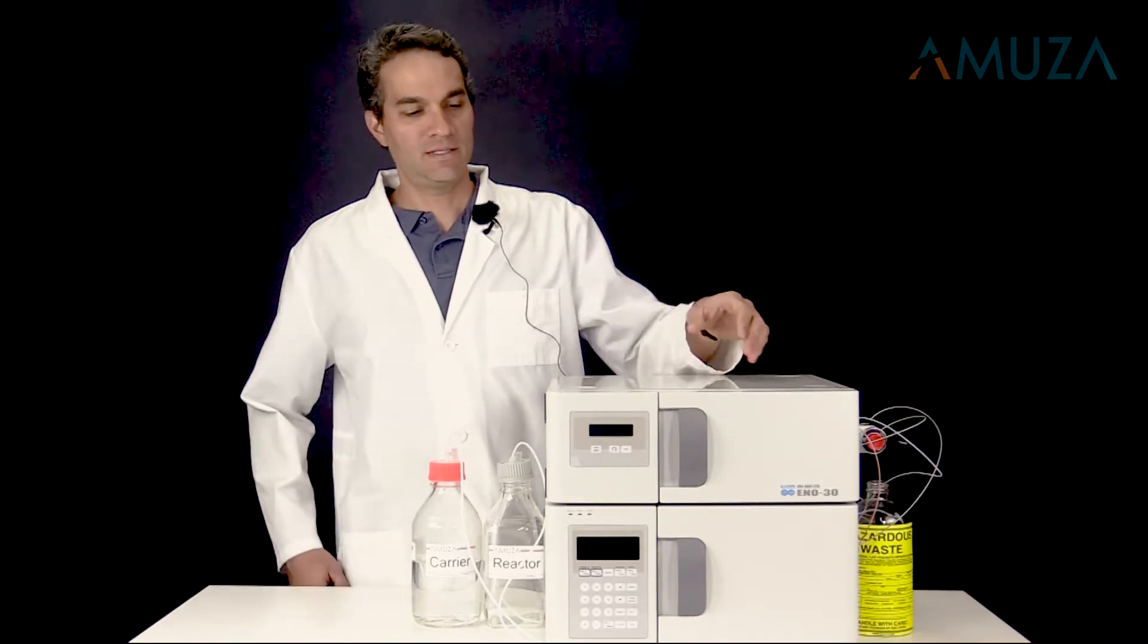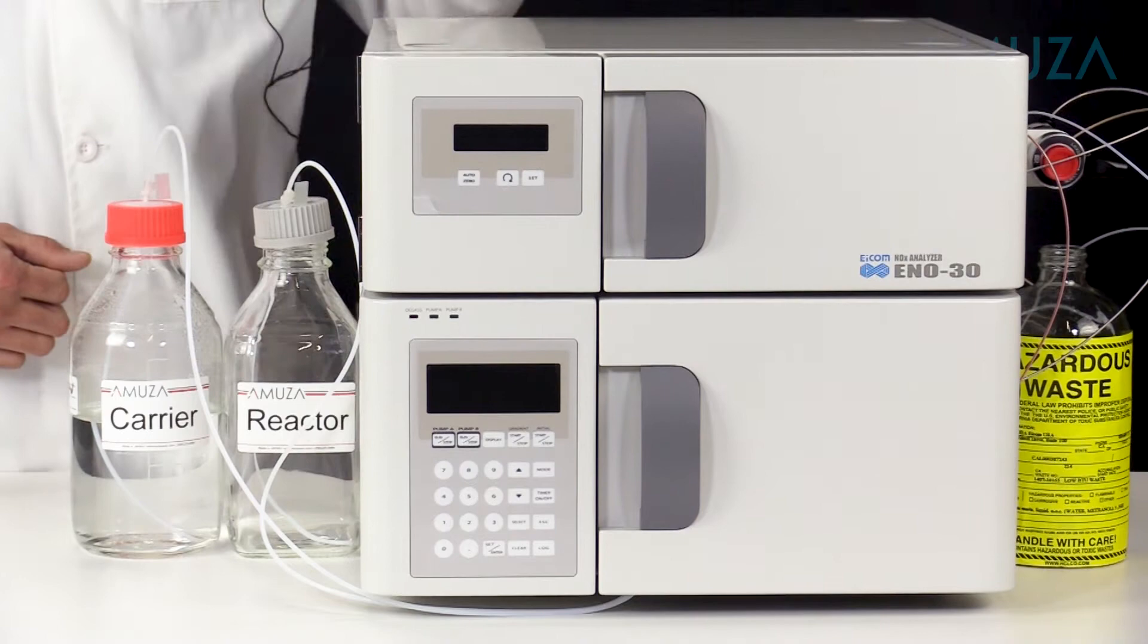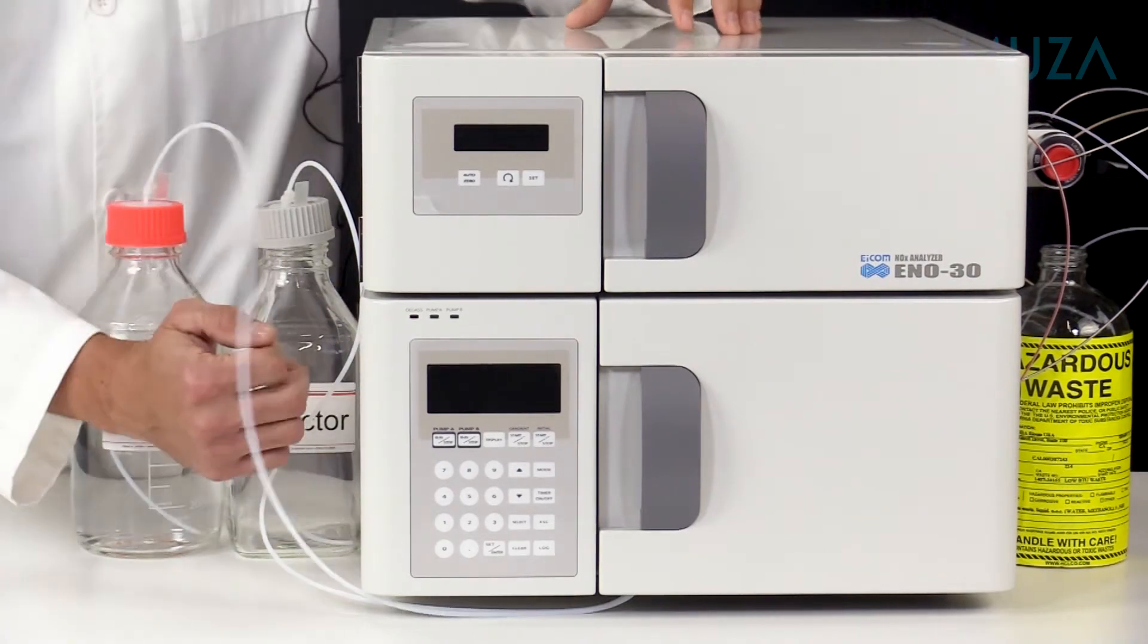Let's take a look inside to see how it works. The ENO-30 has an upper and lower unit.